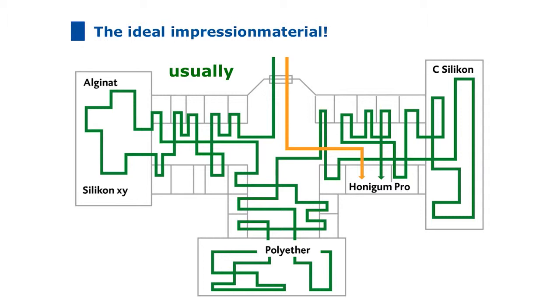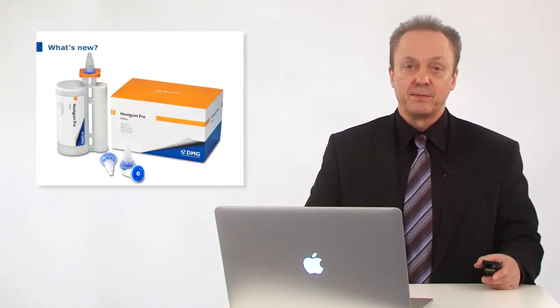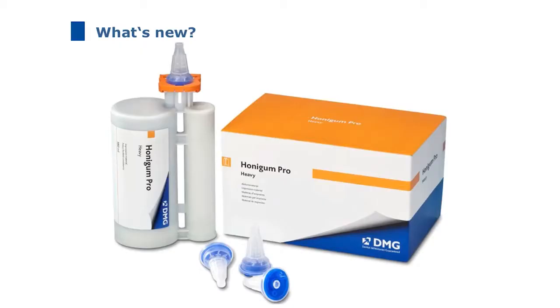Even though the path can really be quite easy, it now leads directly to Honigum Pro. Why is Honigum Pro the ideal impression material? Let's look at some more details in the next few minutes.